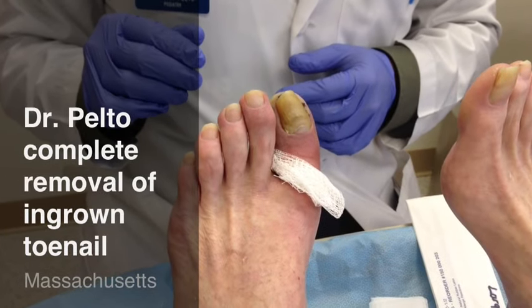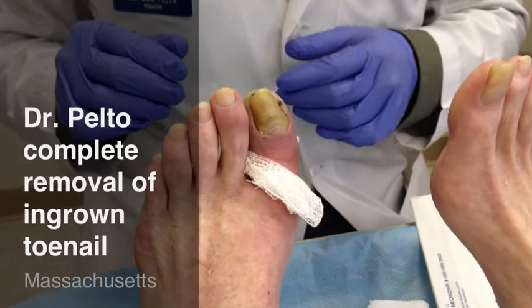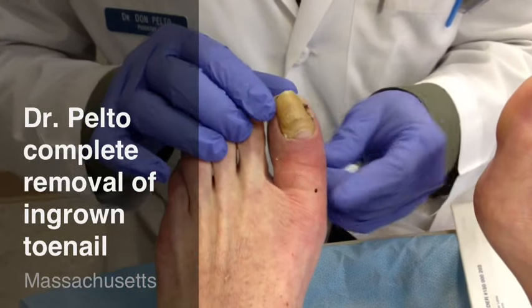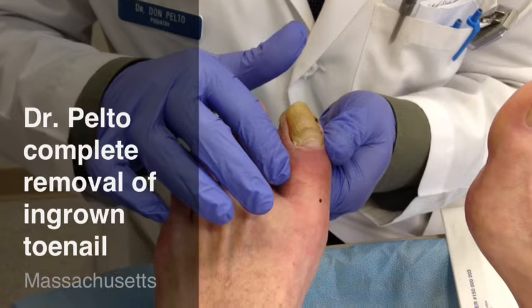Hi, this is Dr. Donald Pelto, and we're going to be doing a total nail avulsion today. If you look at this nail, it was a little bit infected. This patient's been on antibiotics. The redness has come down on the toe.